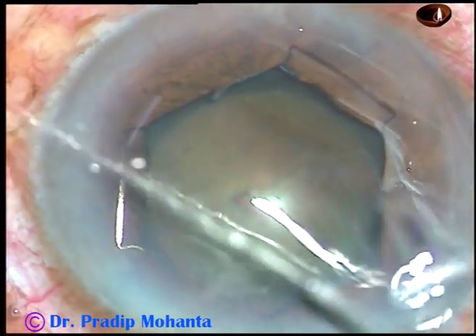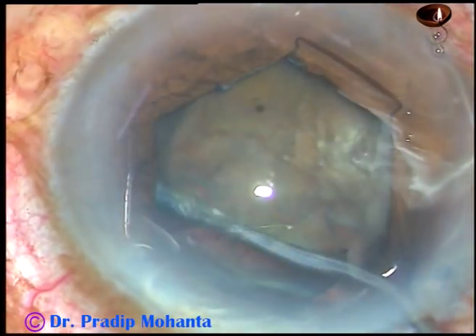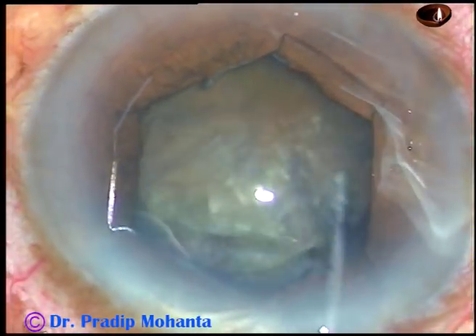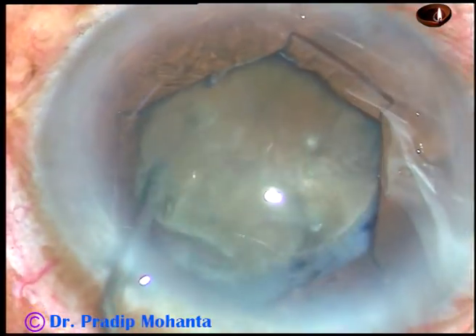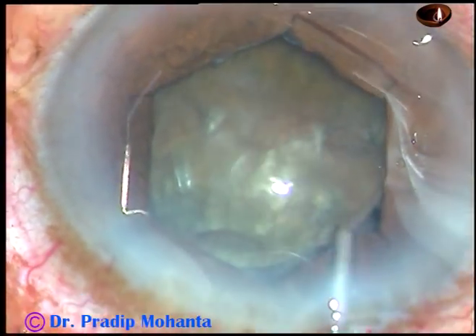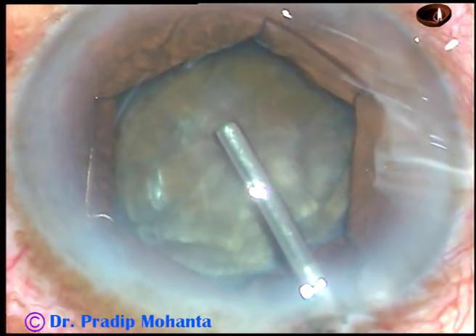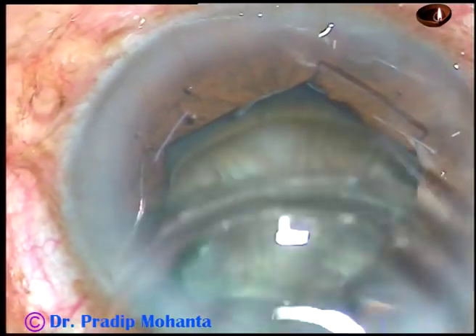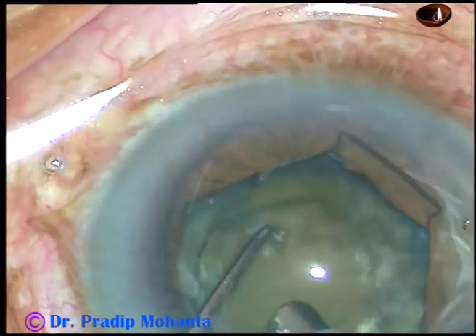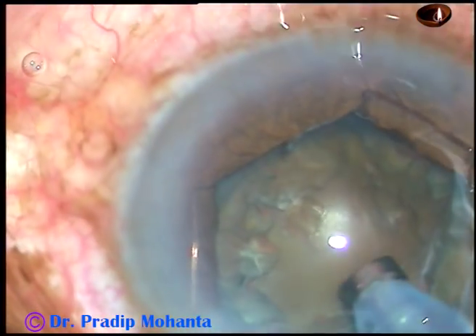And now the hydrodissection is to be done. This is a 27-gauge cannula attached to a 2 cc syringe with BSS. Gentle streams of BSS are injected at multiple points. The nucleus is tried to be mobilised and tapped. Some more hydro is done. But this nucleus is huge and the capsulo-cortical adhesion is much stronger than in other cases, so I could not rotate the nucleus satisfactorily. But enough hydrodissection has been done, and inside-out hydro will occur as I make the first crack.